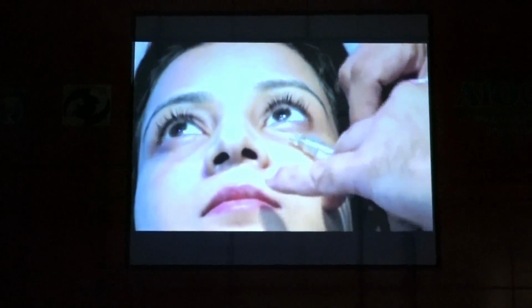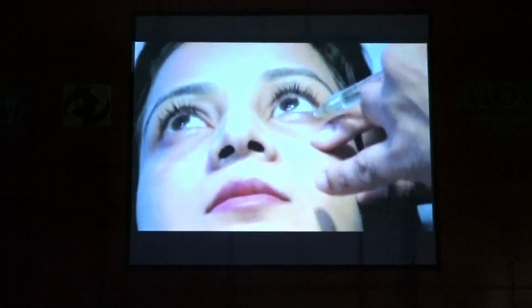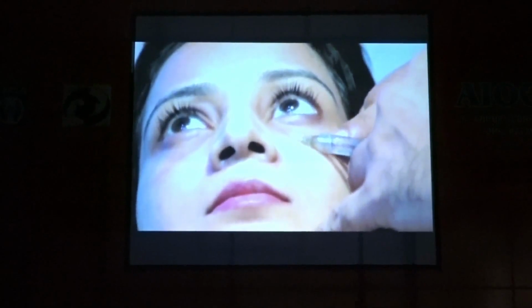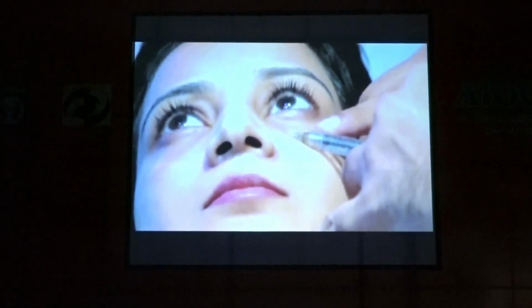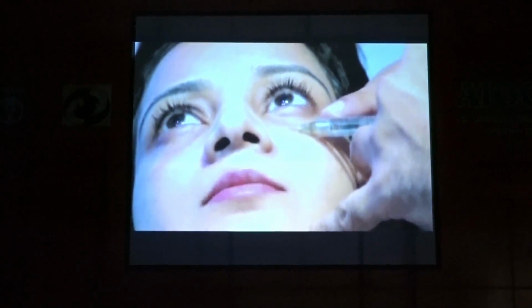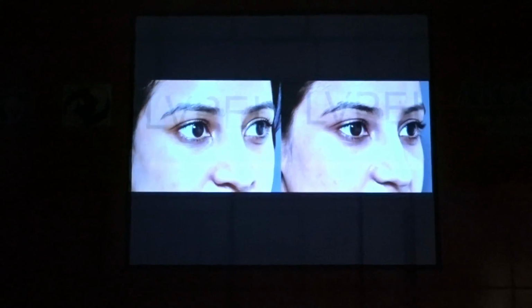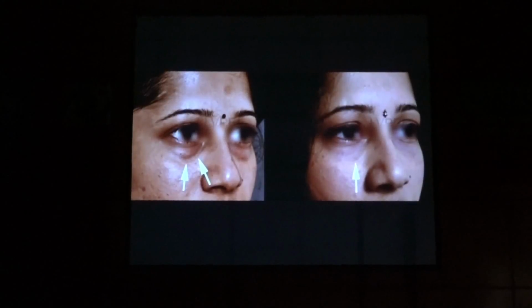Talking quickly about fillers, the most common indication that an oculoplastic surgeon would do is tear trough, and that is basically to treat the under eye hollow with a filler. Filler is nothing but a cross-linked gel, much similar to the viscoelastic used in cataract. So here the product is injected in the epiperiosteal plane to take care of these tear trough, and they vary from person to person. It could be extremely deep, or it could be a combination of fat with a tear trough, and you may have to address both.